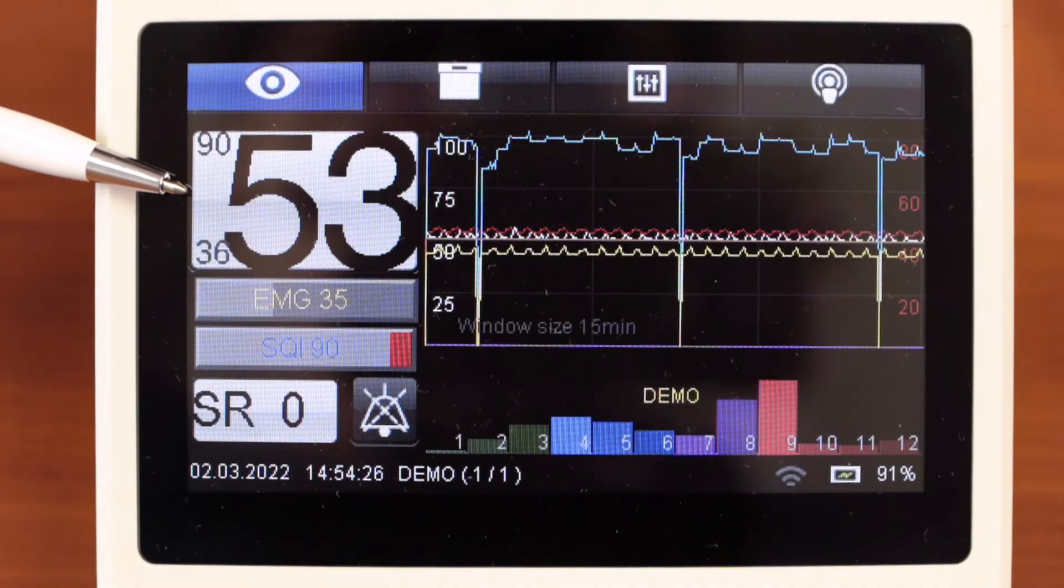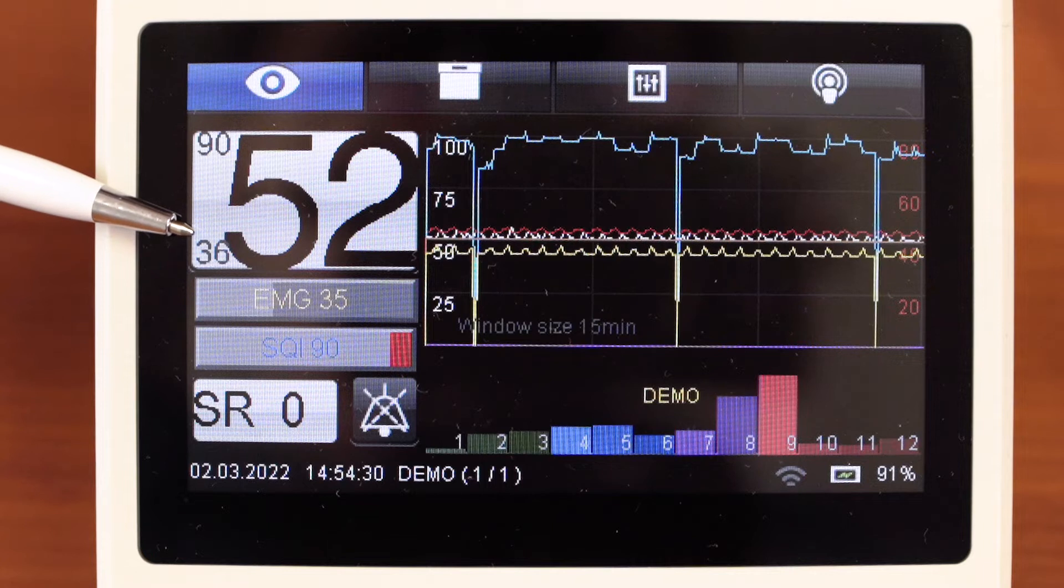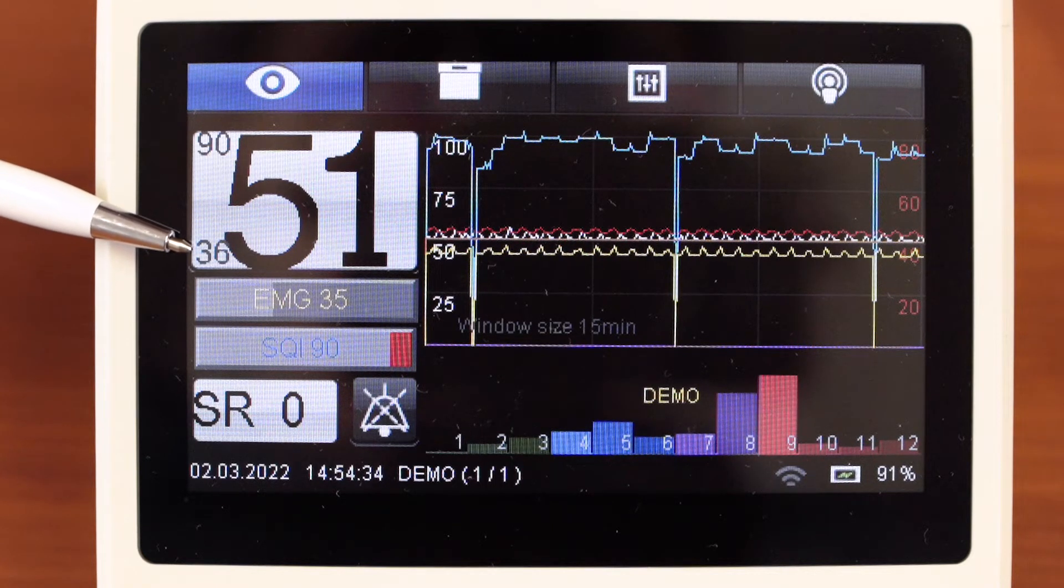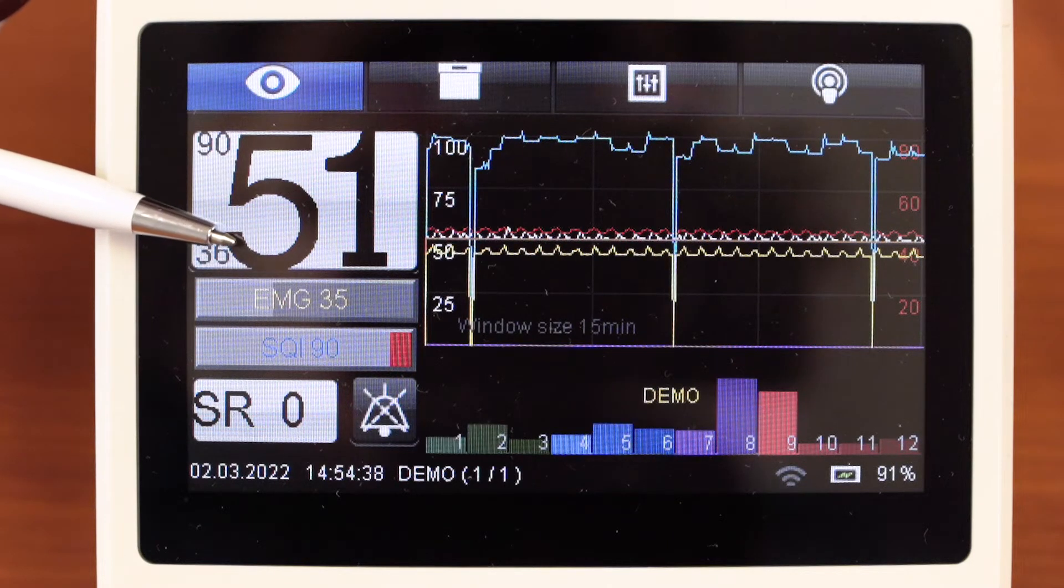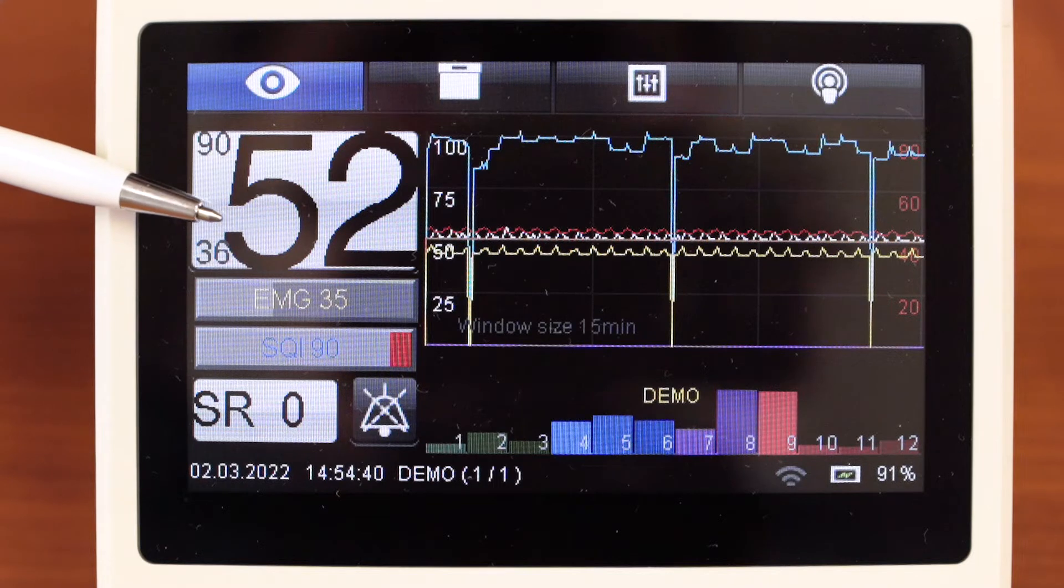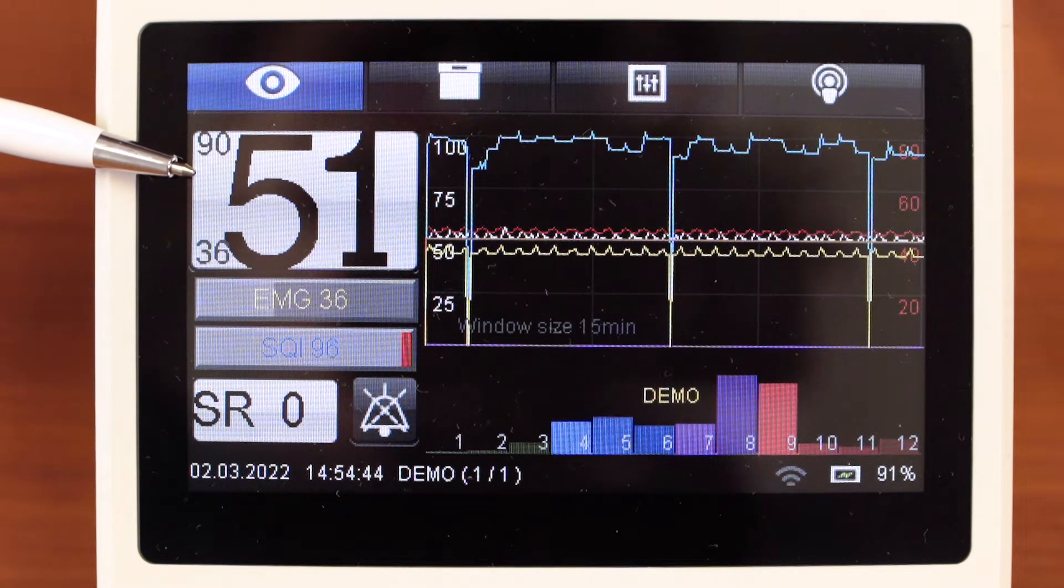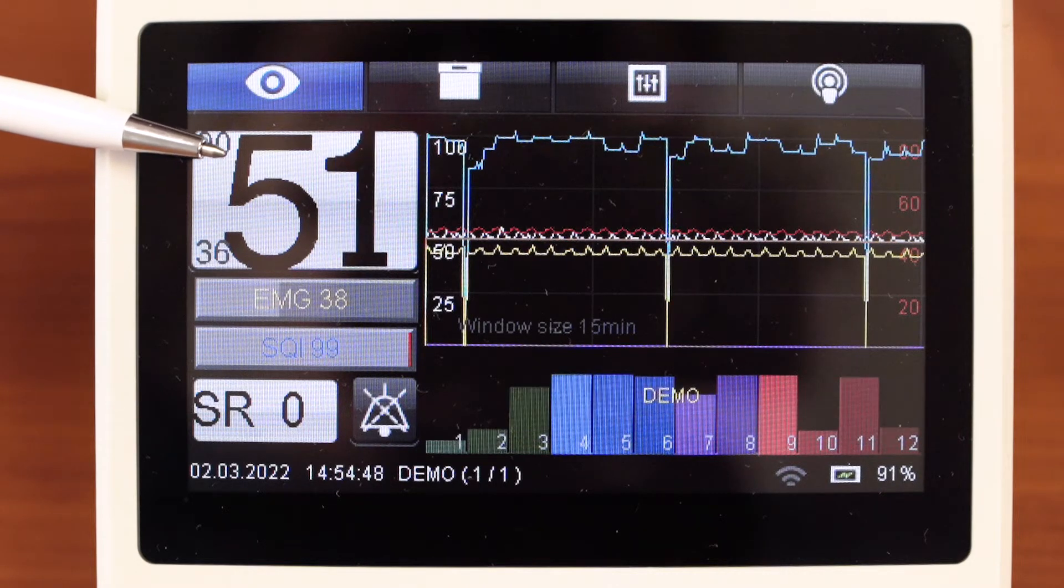Brain activity index is the main parameter. It indicates the level of consciousness depression by analyzing EEG, taking into account the information about typical signs of anesthetic impact on patients. Now activity index is 52. A value from 40 to 60 is a surgical stage of anesthesia.